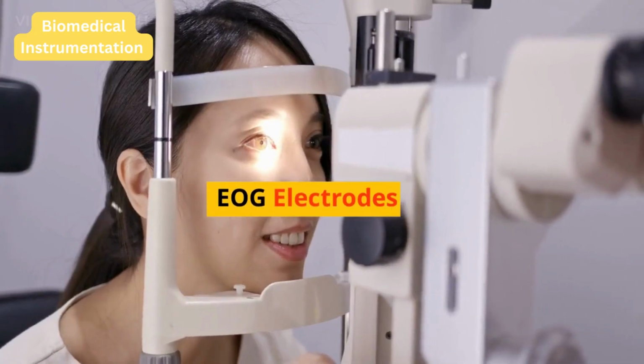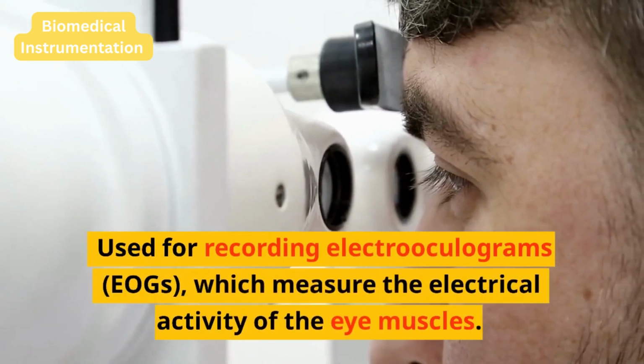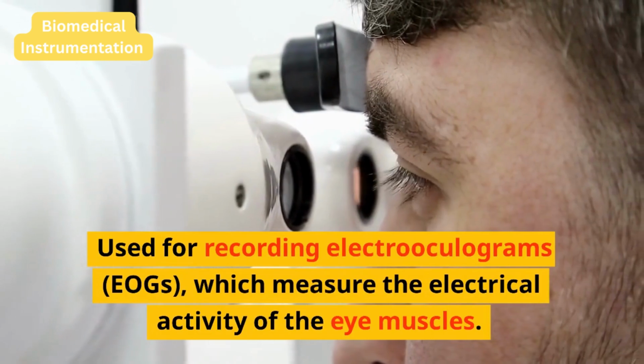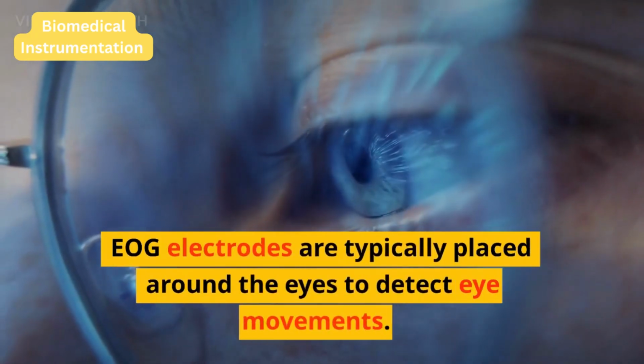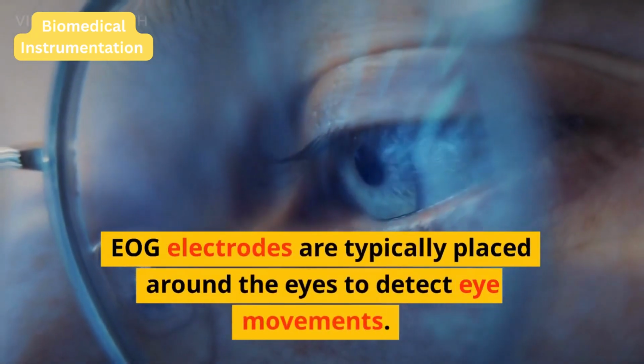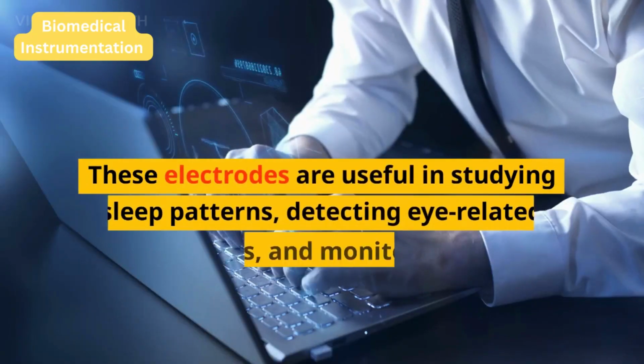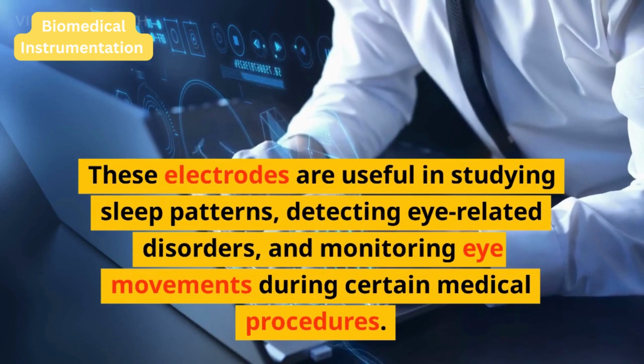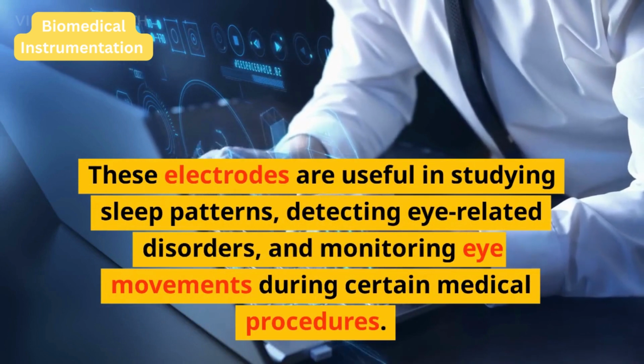EOG electrodes. Used for recording electrooculograms, EOGs, which measure the electrical activity of the eye muscles. EOG electrodes are typically placed around the eyes to detect eye movements. These electrodes are useful in studying sleep patterns, detecting eye-related disorders, and monitoring eye movements during certain medical procedures.